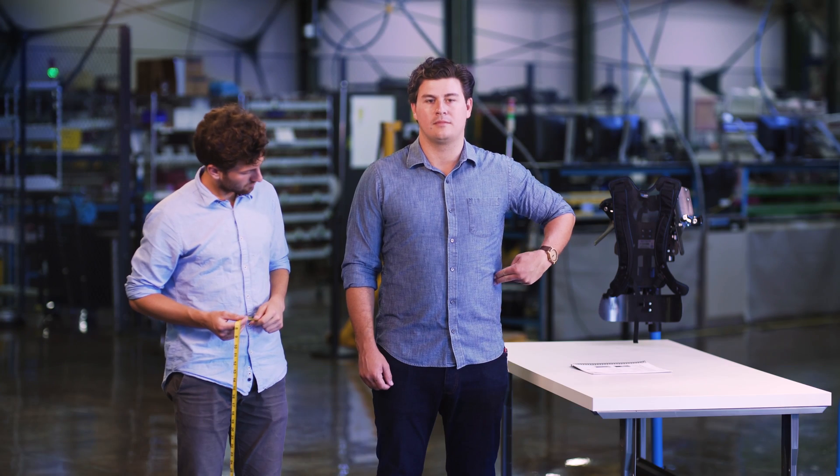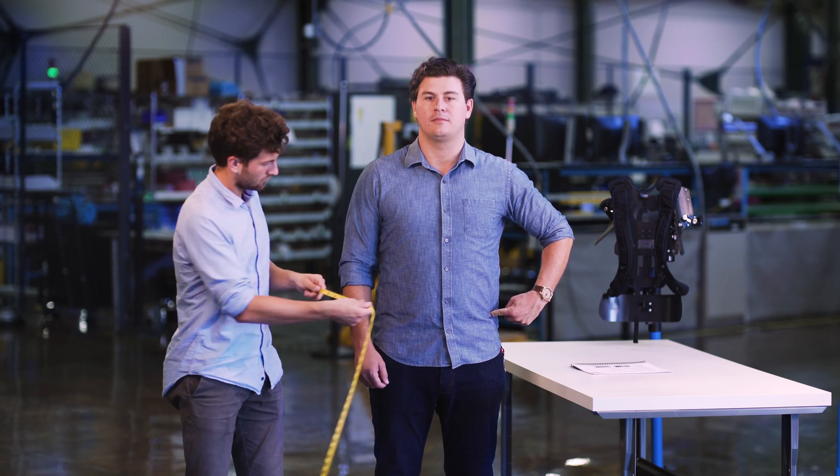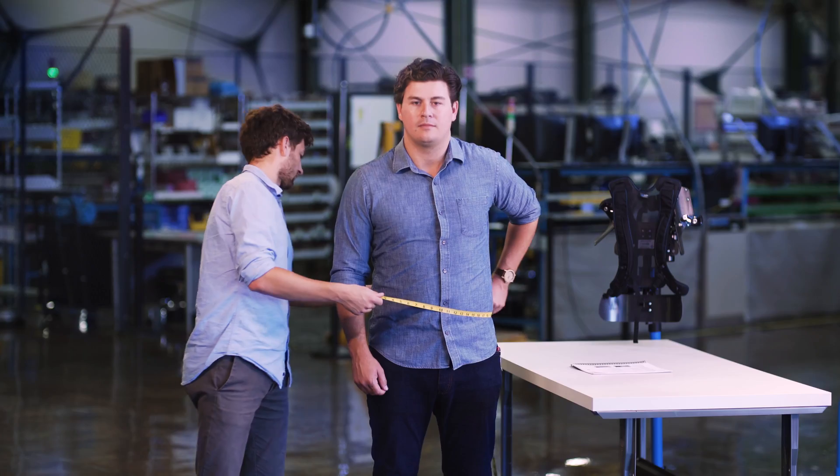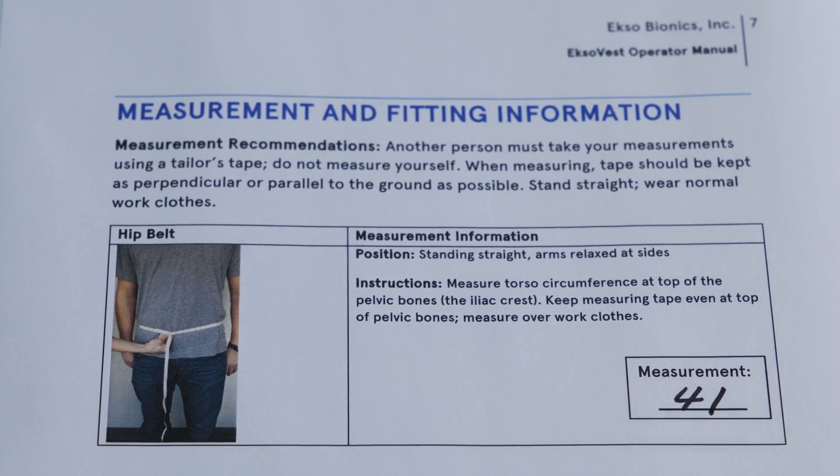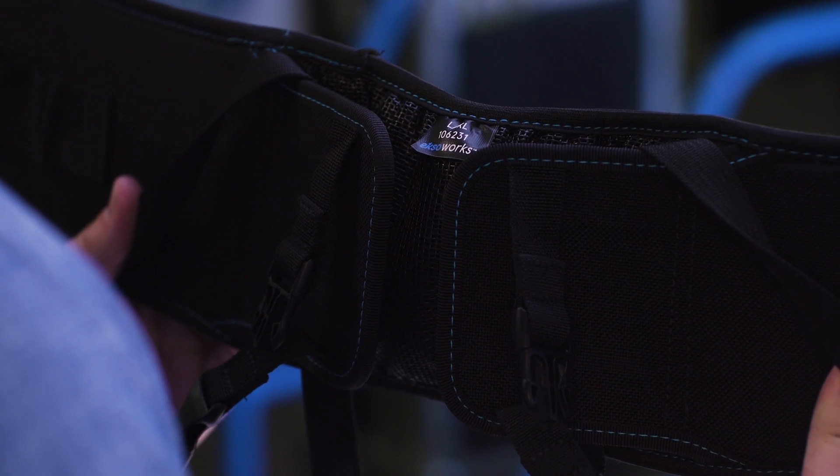For the hip belt, find your pelvic bone below the waist, measure your torso circumference, and write this number down. Zax is 41 inches, so using the table, he'll grab a large, extra-large hip belt.